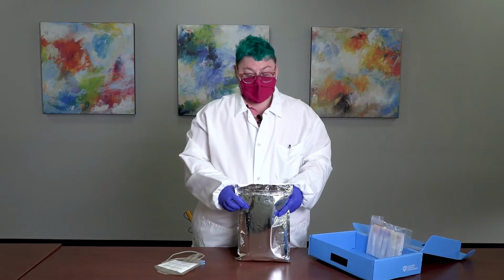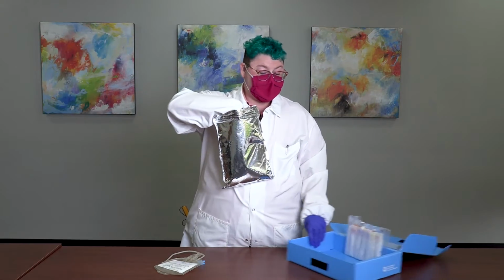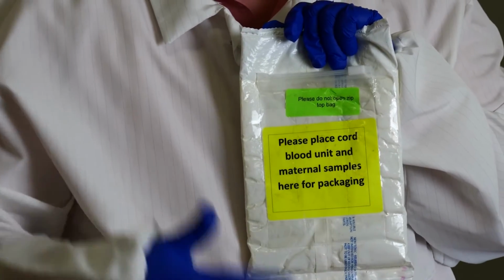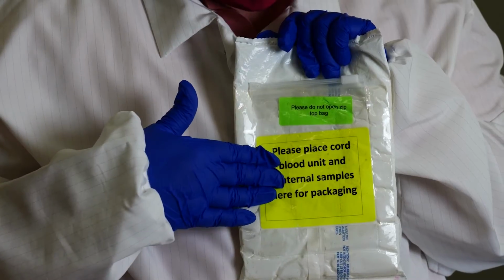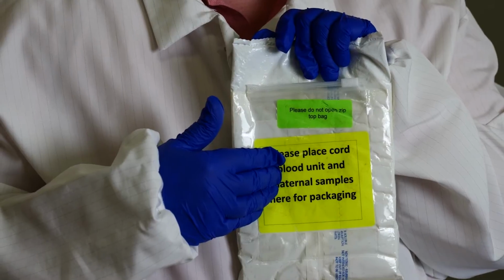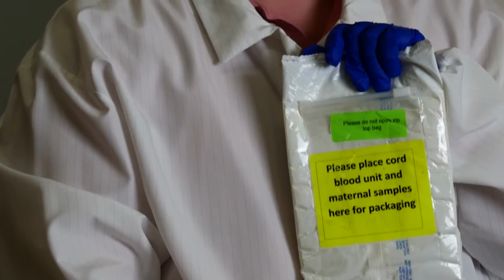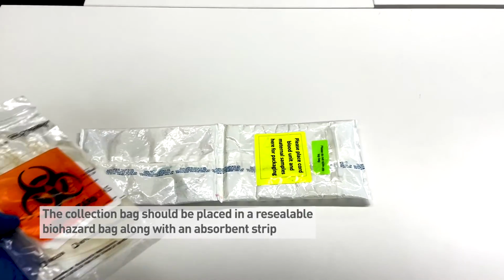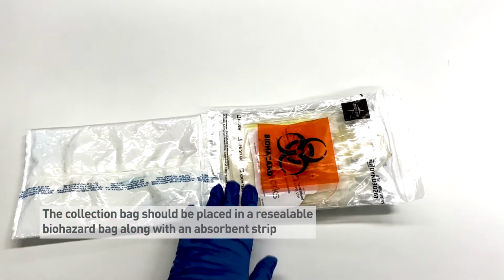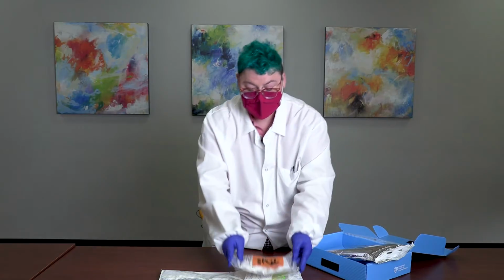To package the collection, you want to remove the foil pouch from the collection box and then remove the gel pack. On the gel pack is a bright sticker where the collection and the maternal samples will be going. Behind that sticker is a temperature monitoring device, which ensures that the cord blood remains at a stable temperature throughout its duration of travel to us. The cord blood unit will be placed on top of the bright sticker that says, "Please place cord blood unit and maternal samples here for packaging." The maternal samples inside the biohazard bag will be placed on top of that.